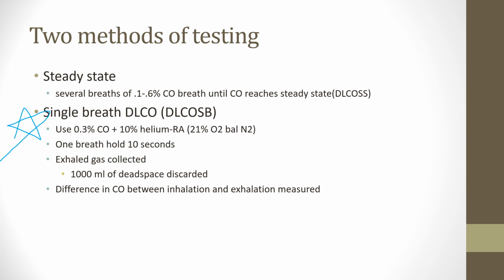So they take one breath in, they hold it for about 10 seconds, and then at the end of 10 seconds, they exhale. The first liter of gas that they exhale, we actually throw out. We get rid of it because it's going to be mixed gas with your mouth and oral pharynx and trachea. It's not going to represent your respiratory zone. It represents more of your conducting zone. And then we're going to measure the rest of it.